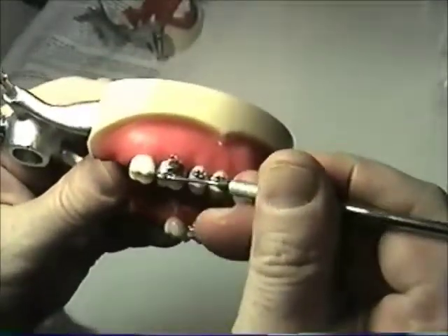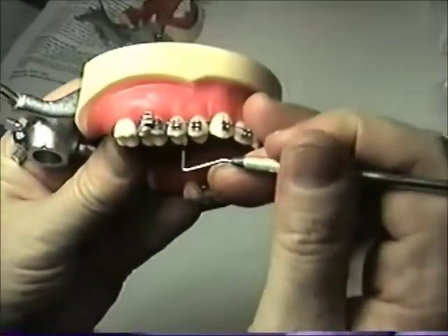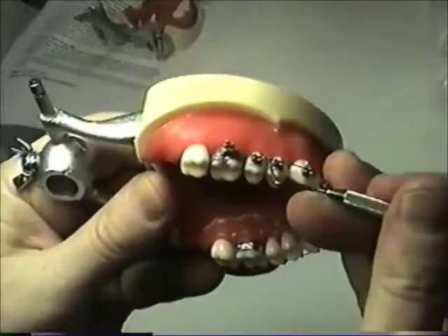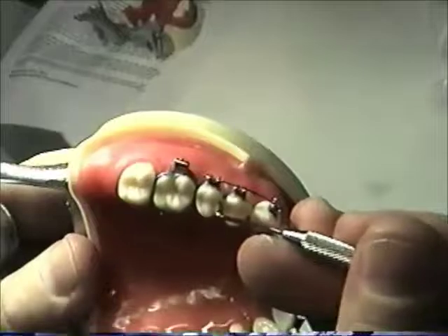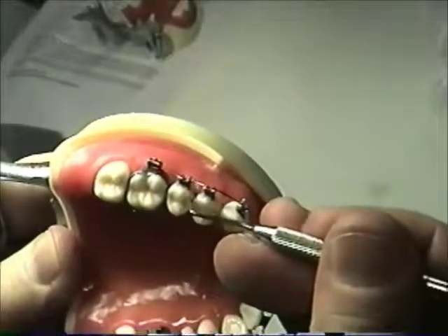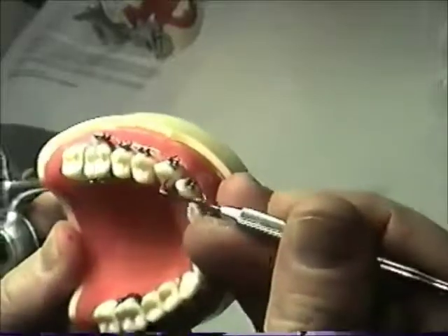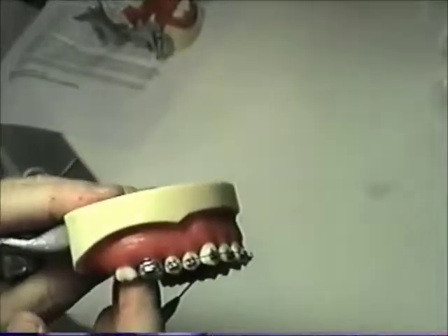But anyway, you go all the way around, and the problem is this wire gets in the way, so you've got to go between the wire and the tooth. And you can't come from this way. You actually got to jam that thing right there and try to spray water up under your gums here and all right here, and you work your way all the way around. That's the purpose of water picking.